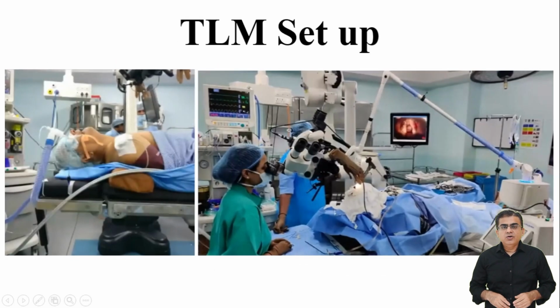Here are some actual photos from operating rooms. On the left side, you can see exactly how the patient is positioned. The patient lies completely flat on the table. Notice how the neck is carefully extended. This extension is extremely important. It creates a straight path for the laser beam to reach the vocal cords. We use a strong suspension system to hold the scope securely in place. This is why the surgeon's hands are completely free.